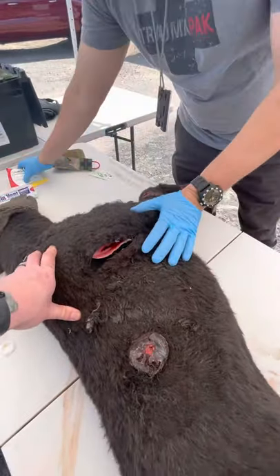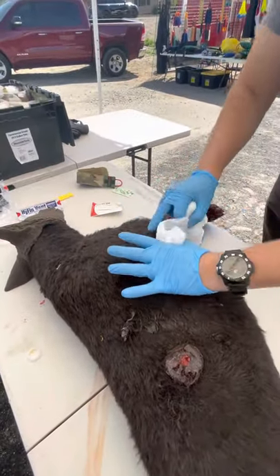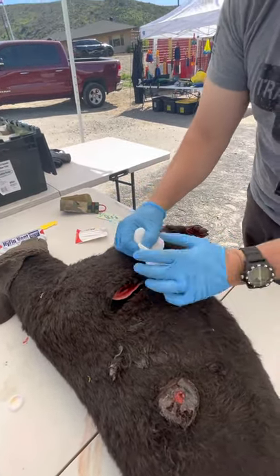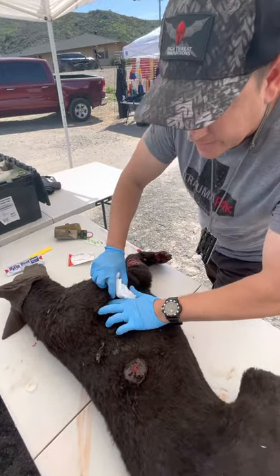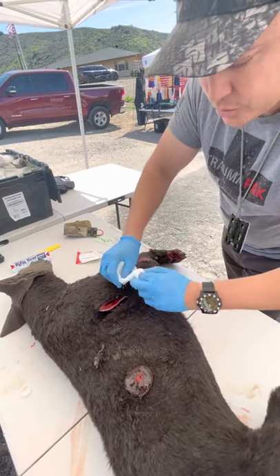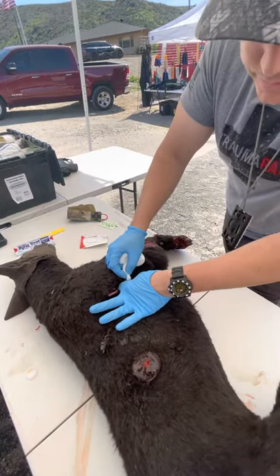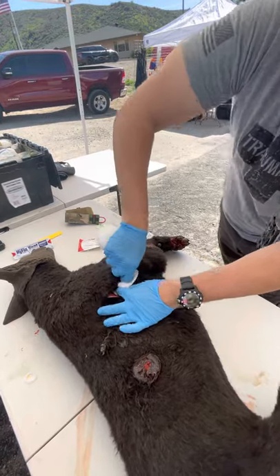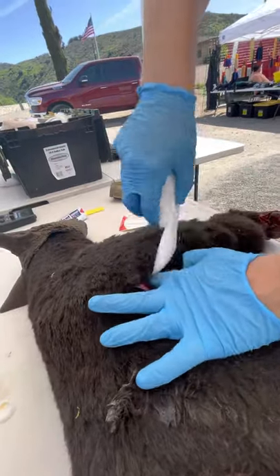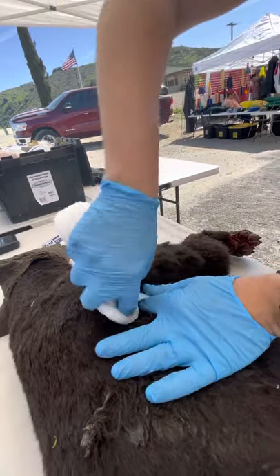In our scenario we would use true QuikClot, but for today we're just going to use regular gauze to show you. I have a junctional area — this could also be in the neck — where a tourniquet or a modified wrap like we just did will not work. I want to locate the source of bleeding; it'll be kind of like a squirt gun, or you feel a pulsating mass. I'll make a little knot with my QuikClot or gauze, insert it into the cavity to feel the location of the pulsating mass, and then pack this wound.